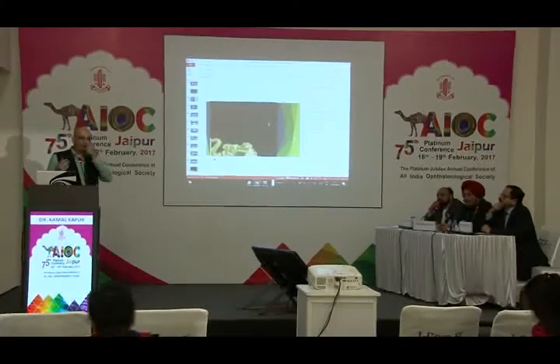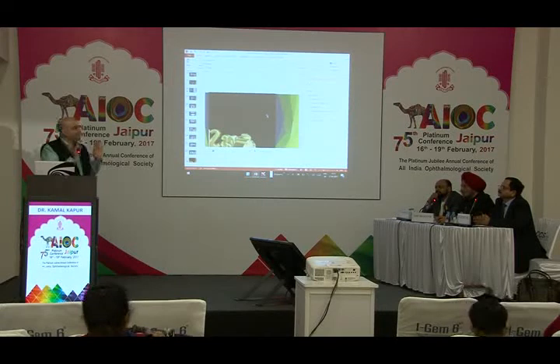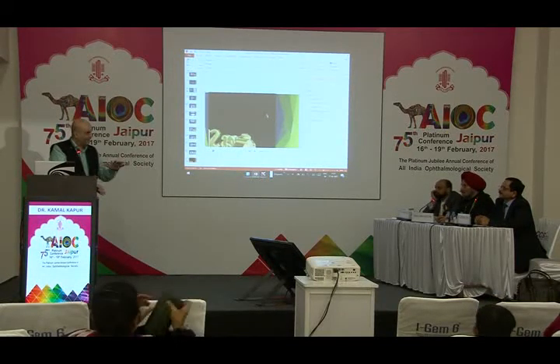this was a lady who said, Doctor Saab, I don't want to remove my original lens. I said I can do a Prelex with a multifocal. No, I want to maintain originality. So I said, we are doing it. Very shortly you will get cataract, and I think at the end of maybe 1.5 months she started getting cataract, so I had to explant that. Other hyperopes are doing fine, no issues.